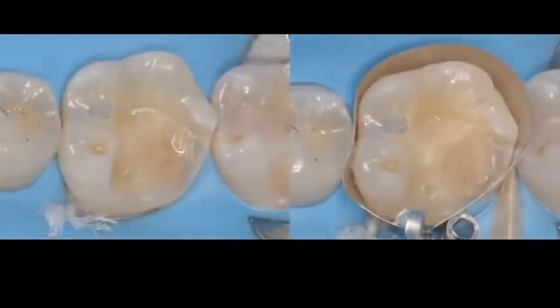Now, that being said, we all know that these materials wear, and the larger the restoration, the faster these materials are going to wear. So we're not going to be able to escape that. They are going to wear, but what we want is to have that wear at the slowest rate possible. That is our ultimate goal.